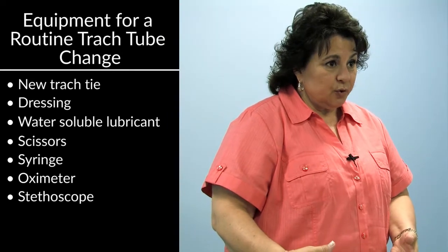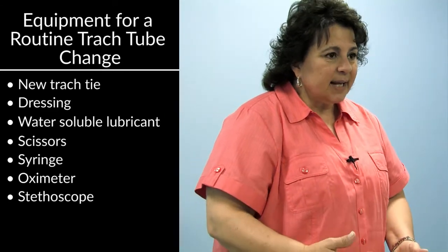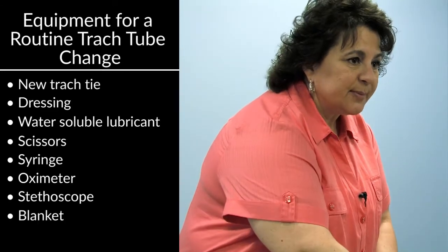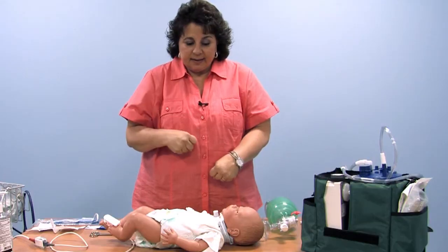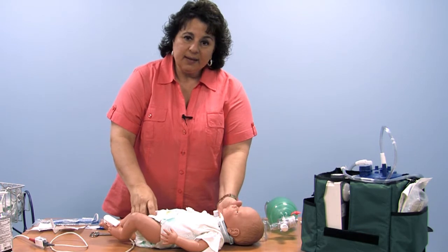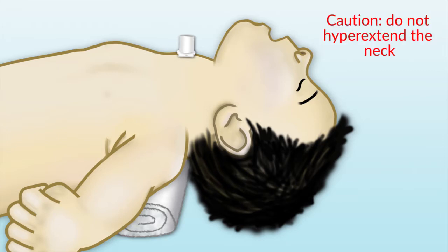For the active child, which my little guy isn't very active today, we would like to have a blanket wrapped around the arms to keep them out of play so little hands don't go grabbing at things. We also, in the infant child, do want to have the neck exposed. We'll put a roll under the back of her neck so her head exposes the area we're going to work with. We don't want to hyperextend the neck, but we would like it back a little bit more than just straight so we can look at this area.